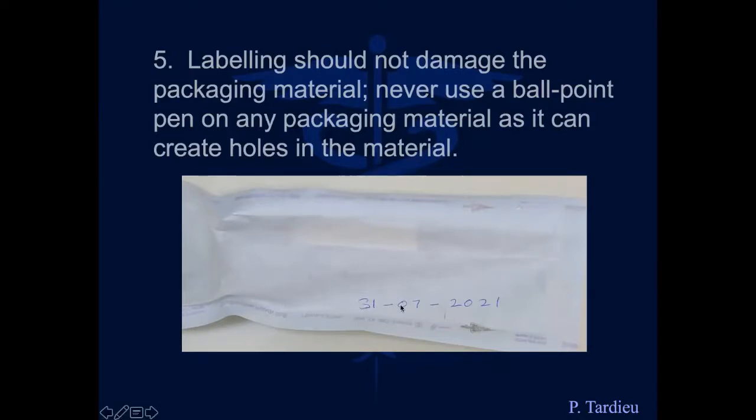When we write something on the other side, like the expiry date, we are not working in conformity with the DHA at all. Not only are we working on the back side, the paper side, but we don't give the full information that is needed. So don't worry about what you're doing. It's wrong if you work on this side. So forget about doing that.